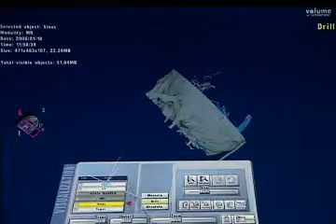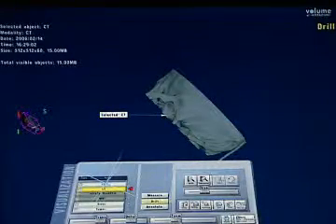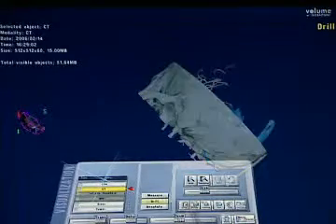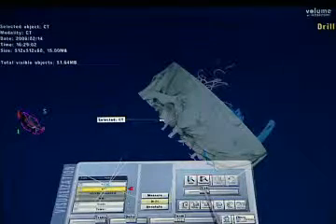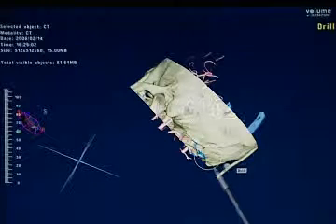And before that, just activate that specific area. I'm just trying to get out the CT and then zoom this image up a little bit so that we could see a little bit better. And from a drill perspective, you now can select the drill size. In the interest of time, I'm just going to simulate it. It's not really going to be, but of course your resident can take his time and do so.